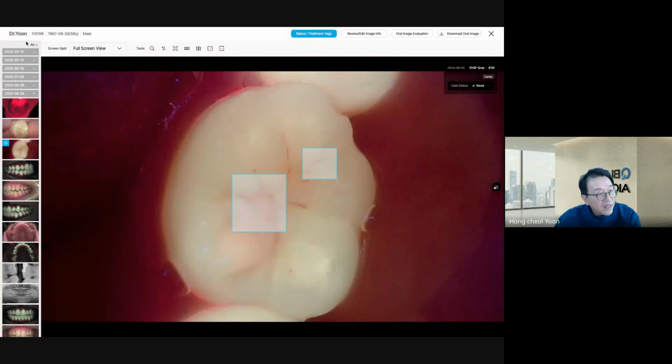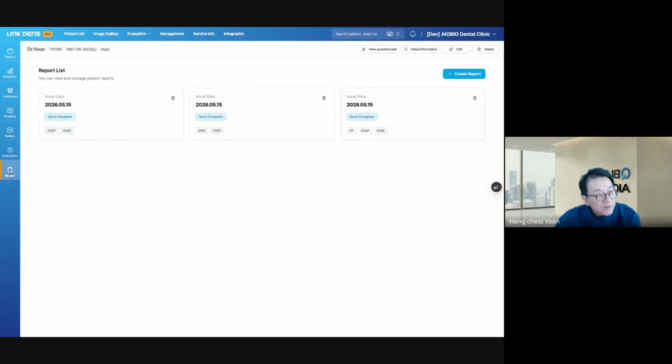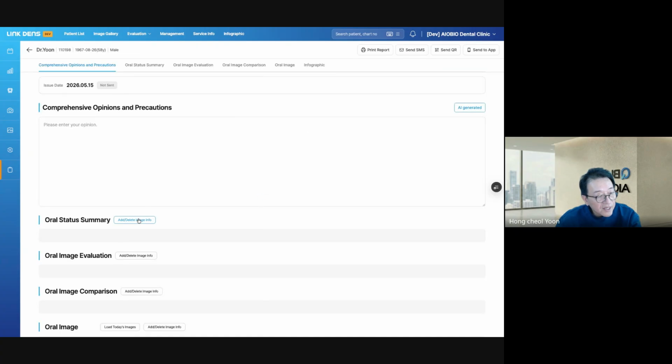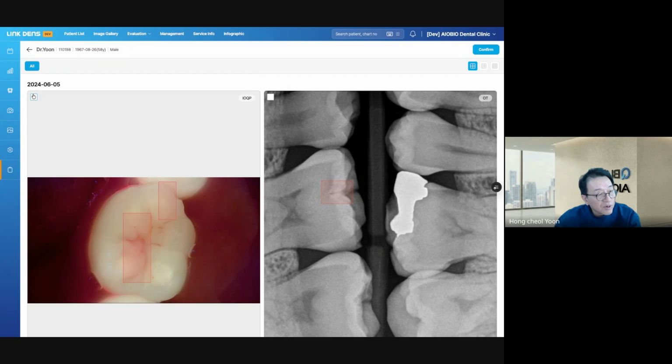Yeah. Then we can make a report for her. So create a report like that. And then information on what image I want to add, this one and this one.